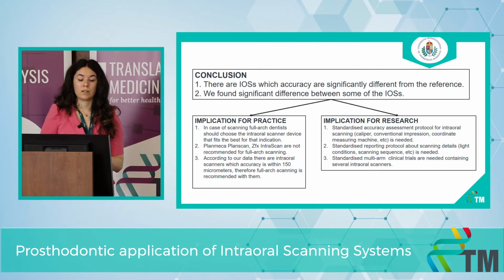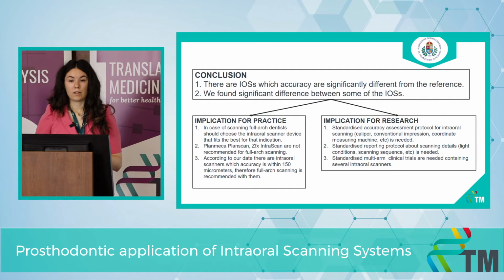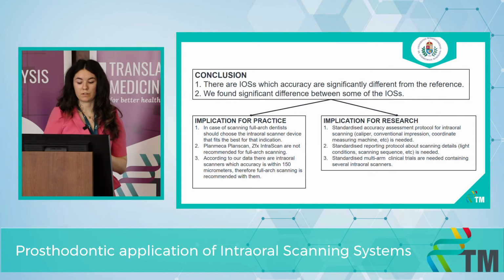And in the implication, we found, for example, that ZFX Intrascan is not recommended for the use for full-arch scanning, and there are available scanners in the market which can be good within the 150 micrometer range.